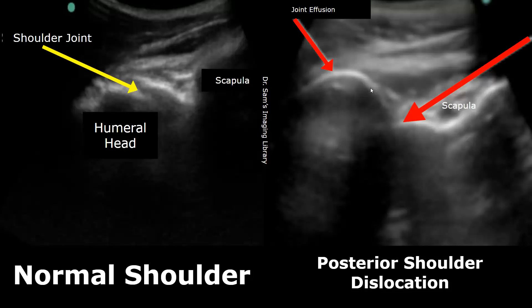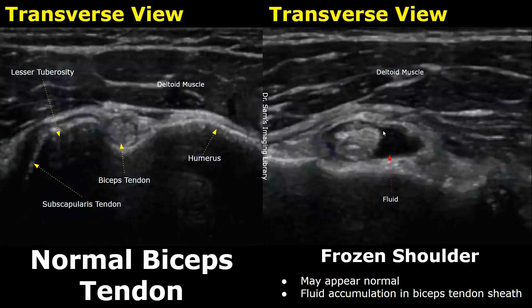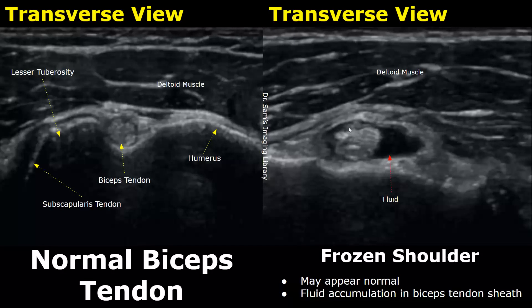This is a case of frozen shoulder, also known as adhesive capsulitis. On ultrasound it may appear normal, but in some cases fluid accumulation in the biceps tendon sheath will be seen. The features are then correlated clinically.